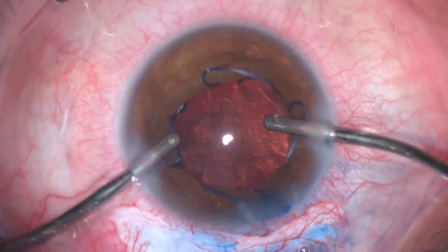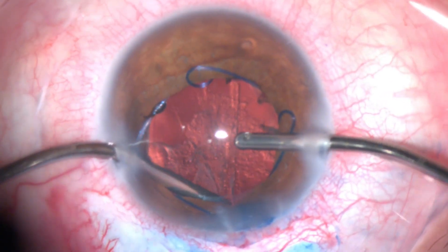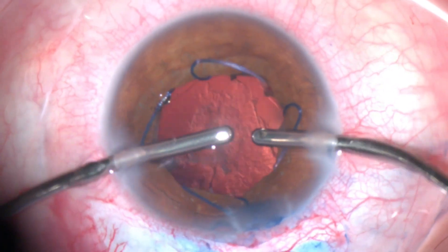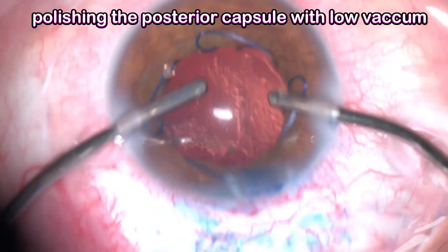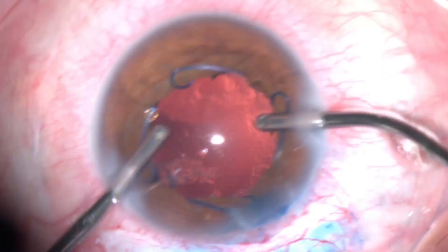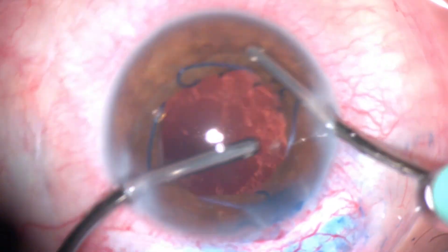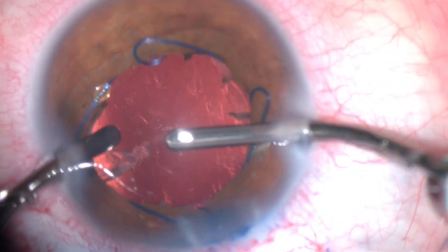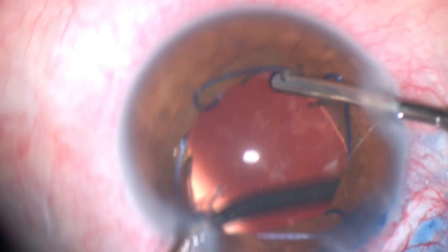Slowly removing the lens fibers — it may take some time and it's a good idea to be patient. Working in different areas, slowly removing and aspirating. I used a polish setting with low vacuum, about 10 to 15 mmHg, and gradually polished the posterior capsule. The main thing is to try to avoid any posterior capsule tear since the eye has already had vitrectomy — you can always do YAG later once the visual axis is cleared.